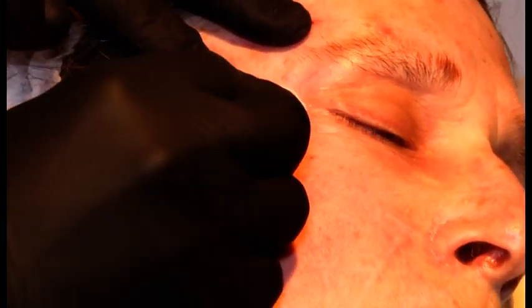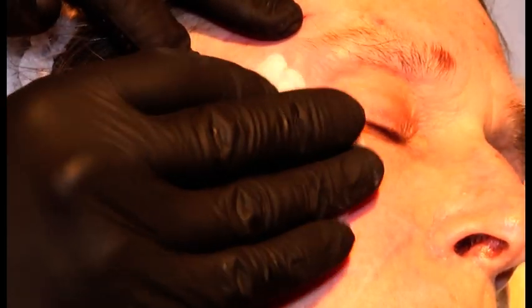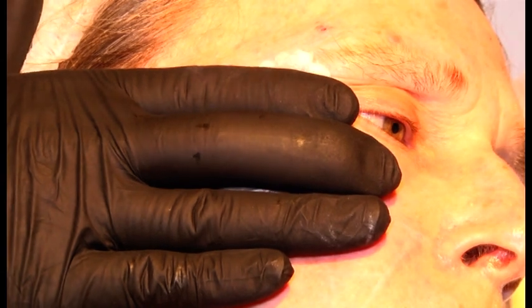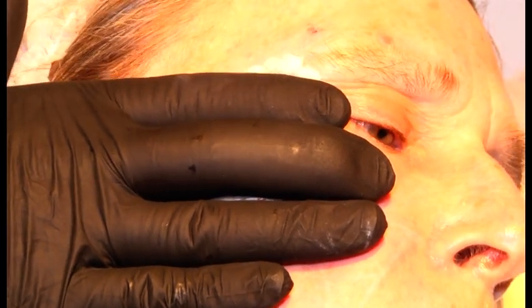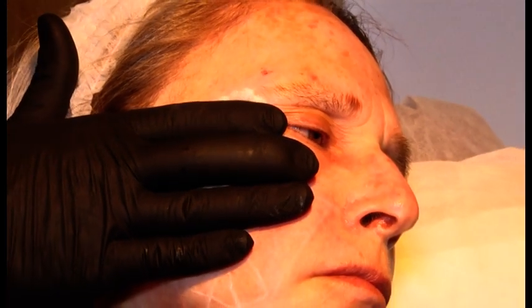So I even it out to reduce the little lumps and bumps, and I put a little pressure because there's always a chance that you've hit something. While we go to the next indication with Belotero Intense.